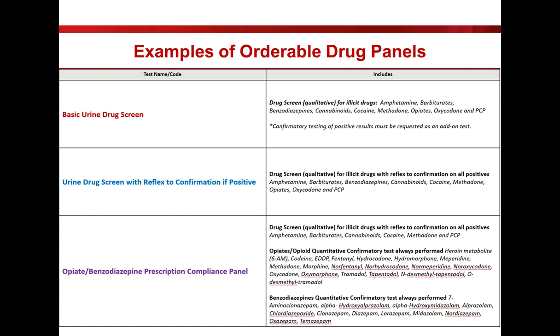So we found this to be particularly helpful in settings where there may be medical legal consequences, or in the outpatient setting when a physician would order a test but not have the time to look at the results and call the lab to add on the confirmation testing before we'd already discarded the sample. Typically, given the volume of our hospital, we really can't store samples for more than probably about 3 days. And so a lot of physicians were missing that window and then upset because we weren't able to add on the confirmation. So this was definitely helpful there.